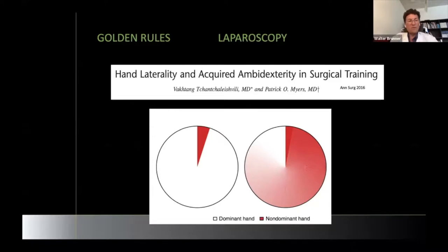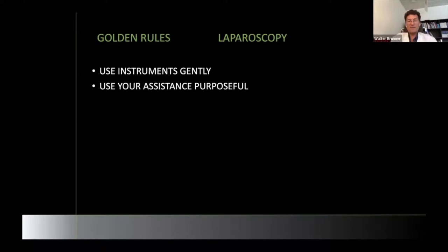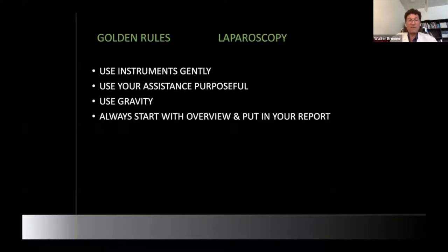You should be aware that sometimes your instruments work better coming from one side than the other, and you should switch instruments to the other side accordingly. You should always use instruments very gently, not rupturing tissue. Use your assistance purposefully — some assistants are more in your way than helping, so position their instrument perfectly for you. Use gravity, always start with an overview and put it in your report.